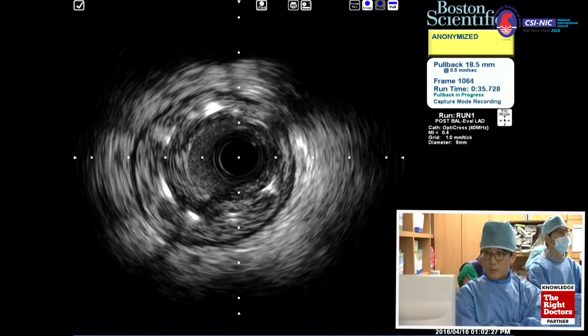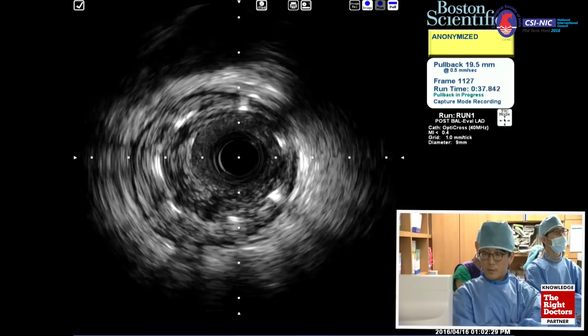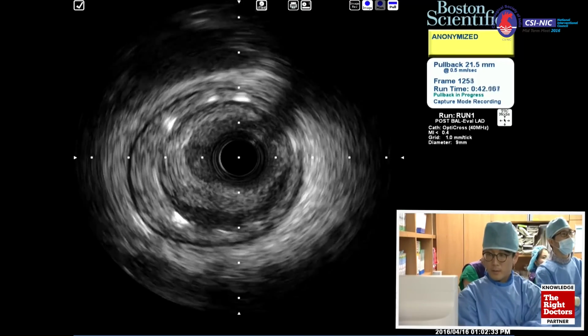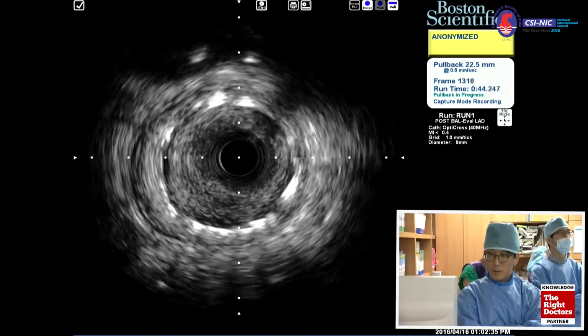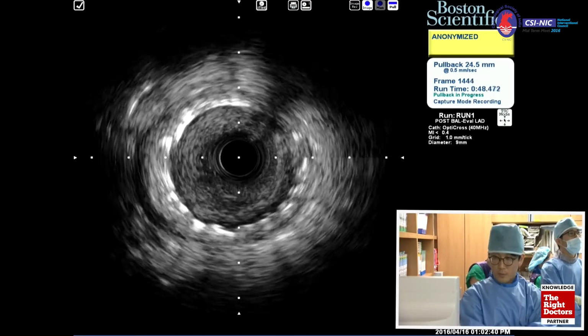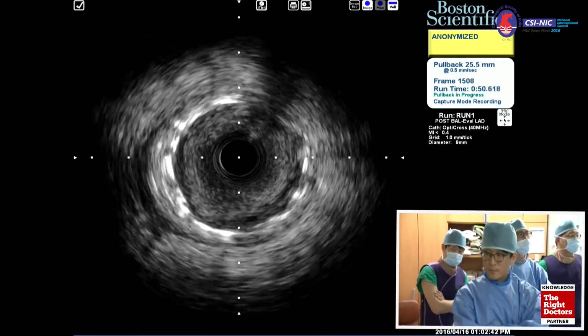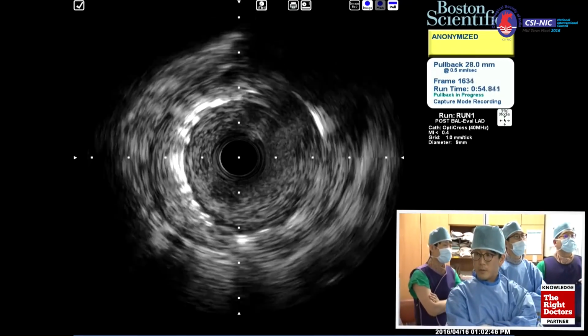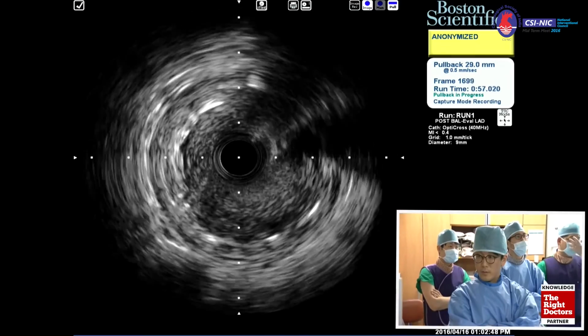Here, I have it, focal. There is some plaque in the intima portion here. Hyperplasia, yes, right? Mainly. All right, stent diameter is almost 3.5, which means stent expansion is quite good, right? And mainly intima hyperplasia is the cause of this ISR.